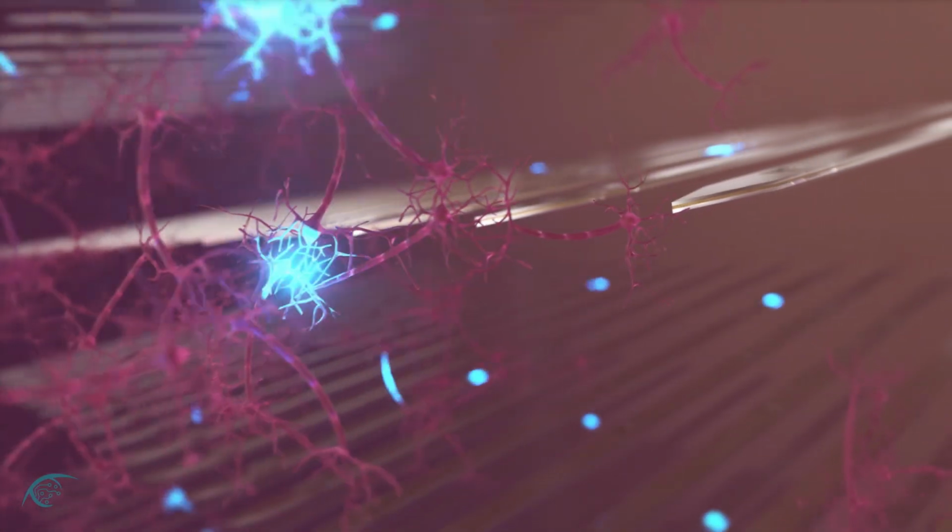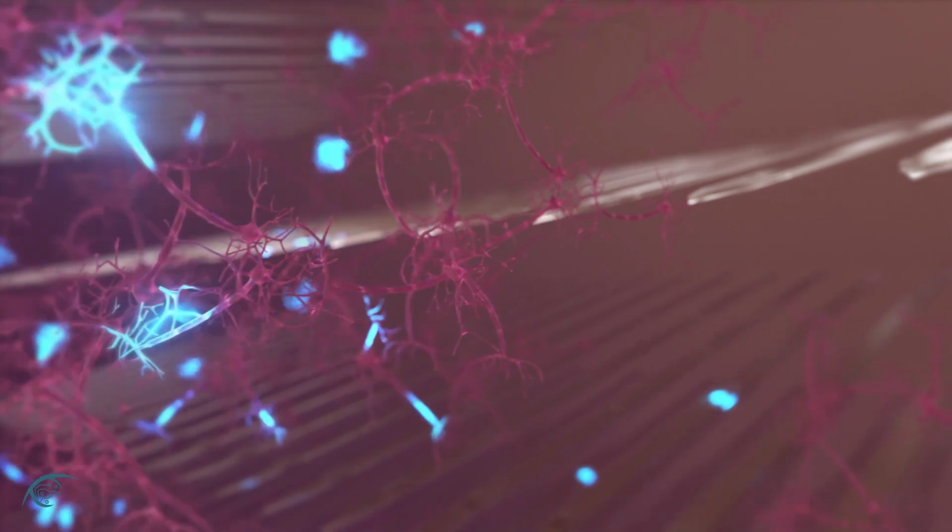They are shaped like tiny little wires and are extremely thin, having a thickness similar to a single nerve cell. By placing the electrodes closely to the neurons of the brain, only a few tens of microamperes are needed to produce visual sensations, and a high resolution can be obtained.